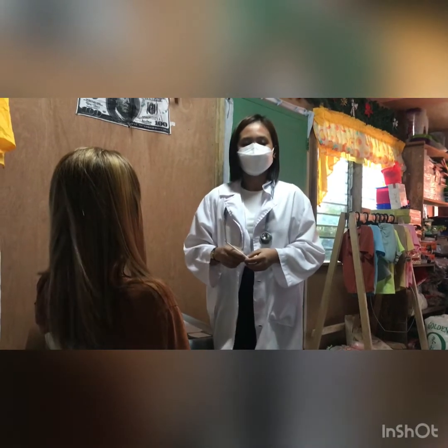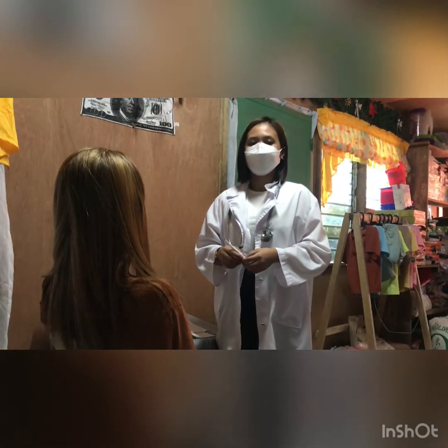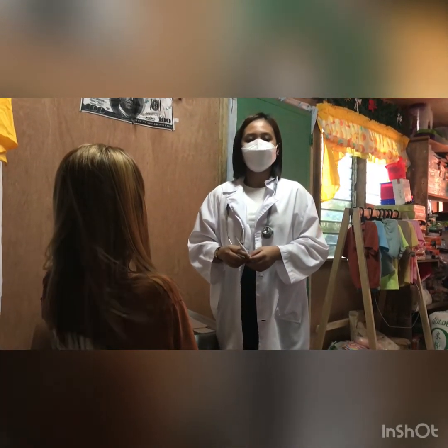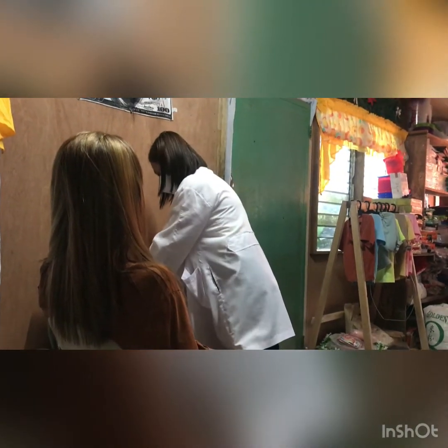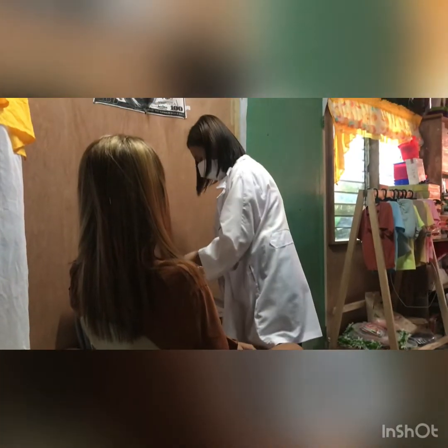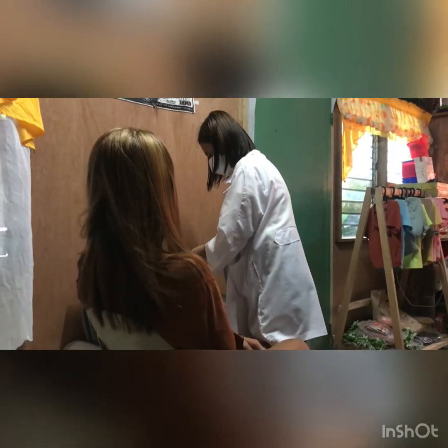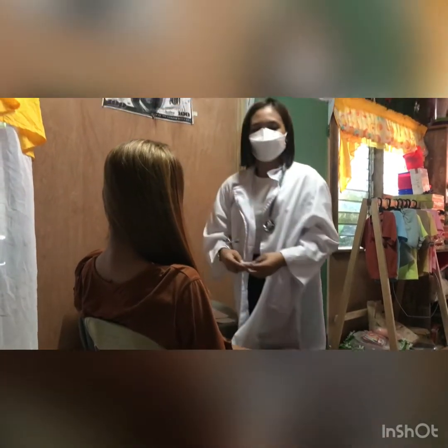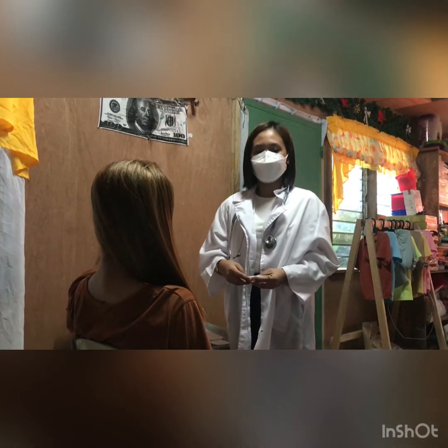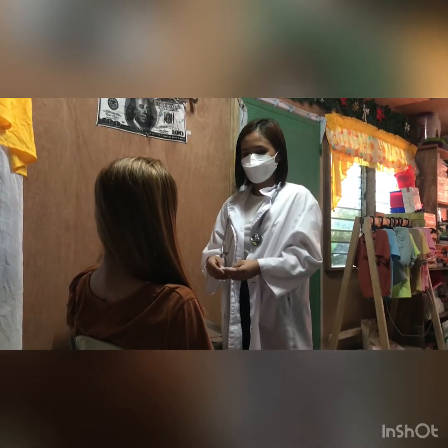Then, with a cotton ball, wipe the thermometer in a rotating motion from the temperature sensor to the neck. Then place the thermometer in the center of the patient's axilla.